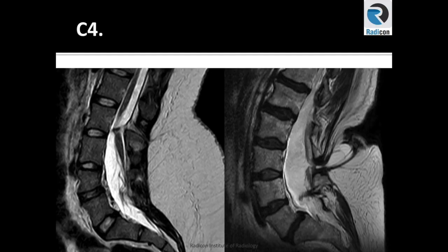Let's see the fourth case in the conus abnormality, hence it's labeled as C4. You have seen part of it previously in the scoliosis section. You can see tethering of the conus which is low-lying to the level of L4. Normally it should be at the level of L1 or L2.